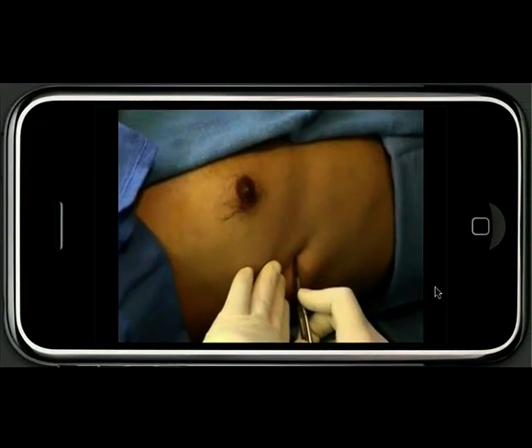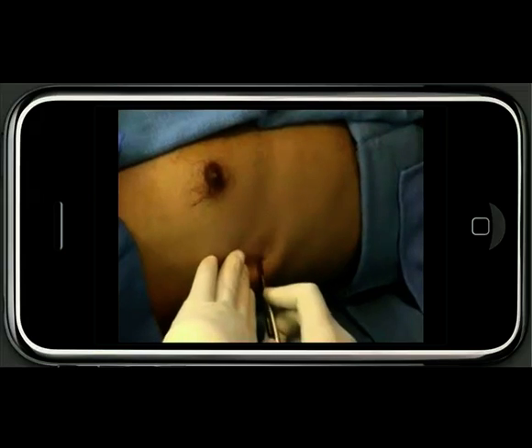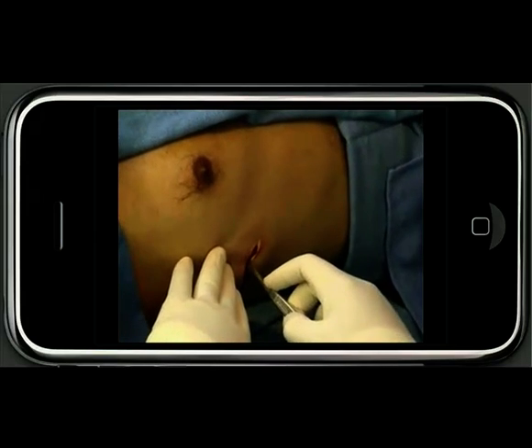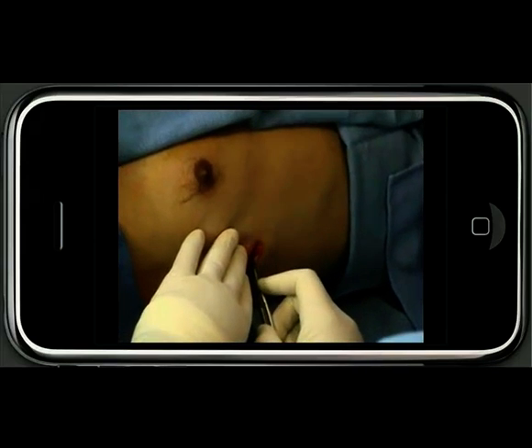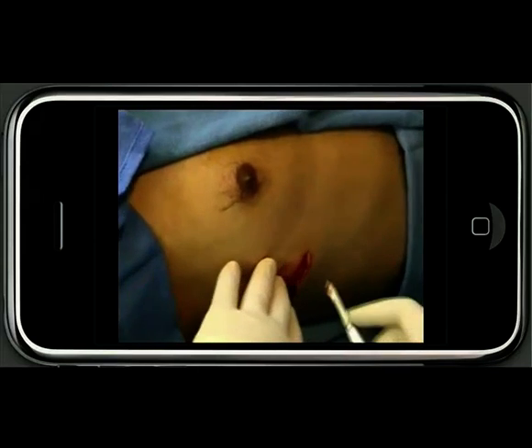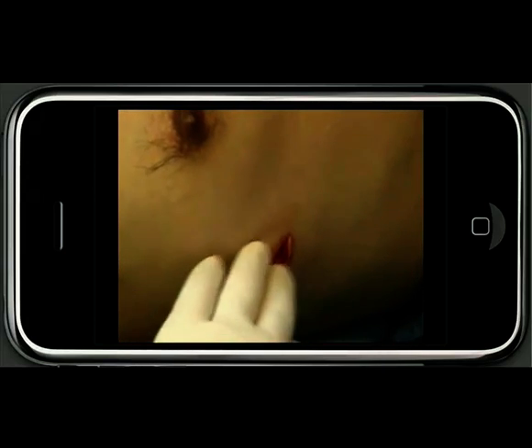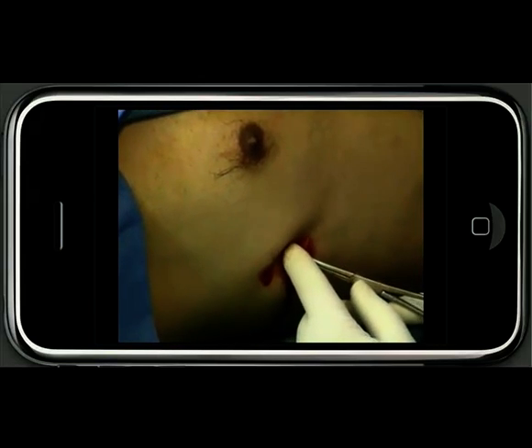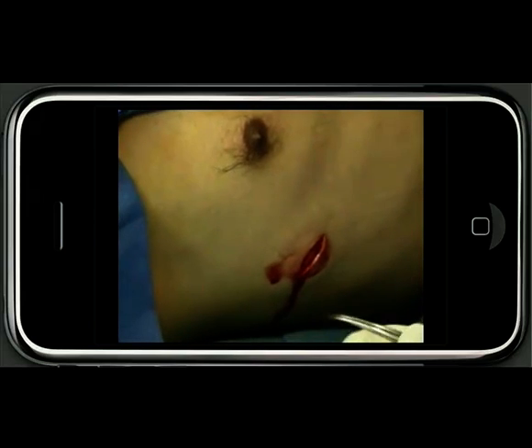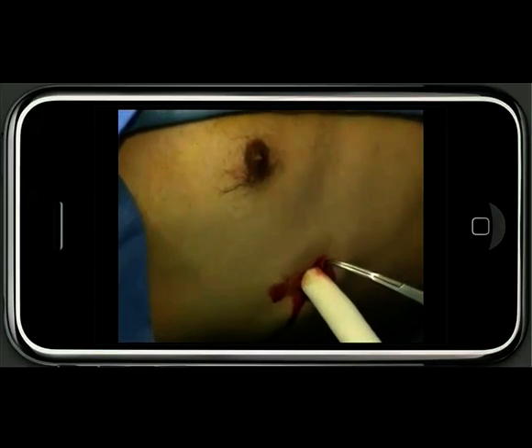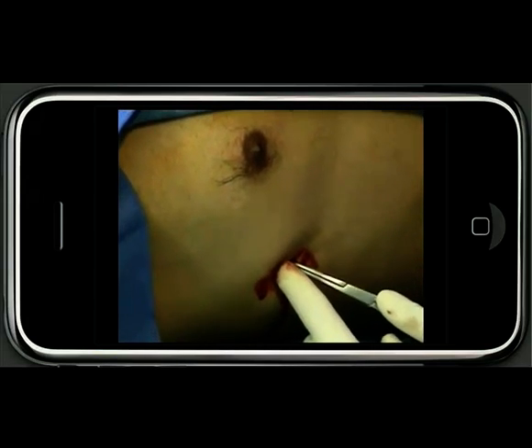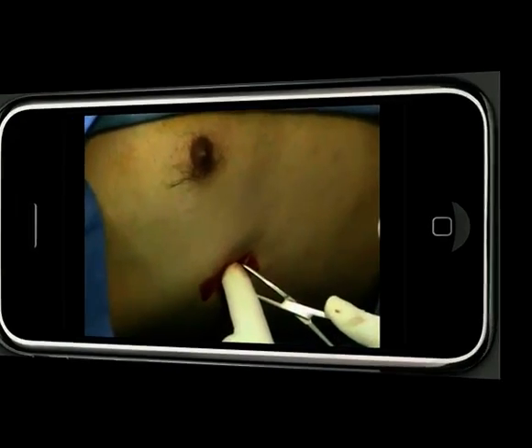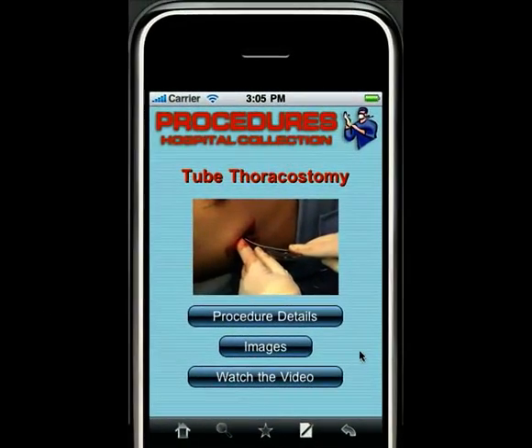Here, the scalpel is used to make a three-centimeter skin incision parallel to the ribs in the 5th intercostal space. Blunt dissection is carried out with a curved Kelly clamp over the rib superior to the skin incision and through the intercostal muscles. That's an example of the video contained within Procedures Hospital Collection.